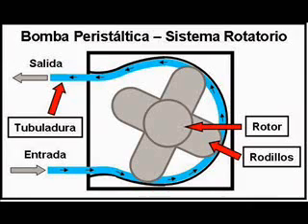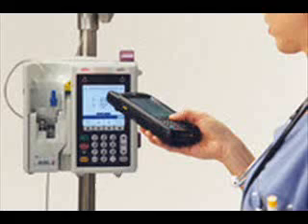The part of the tube under compression is closed, forcing the fluid to move out. Additionally, as the tube opens to its natural state after the passing of the cam, restitution or release, fluid flow is induced.